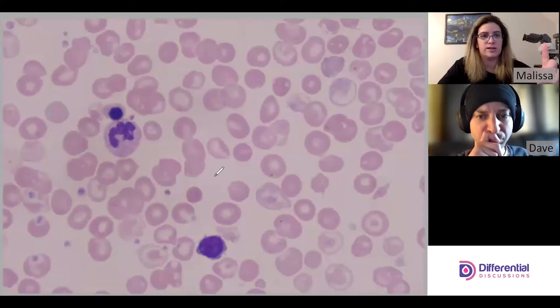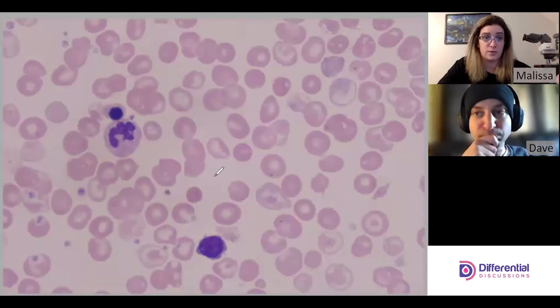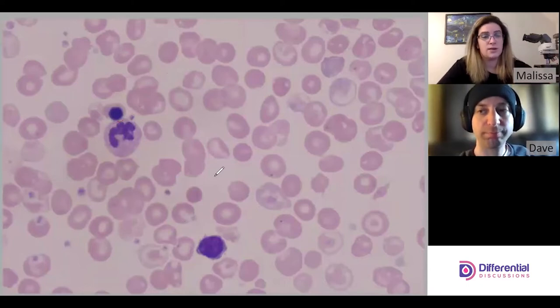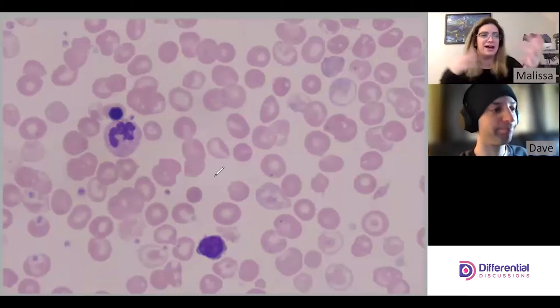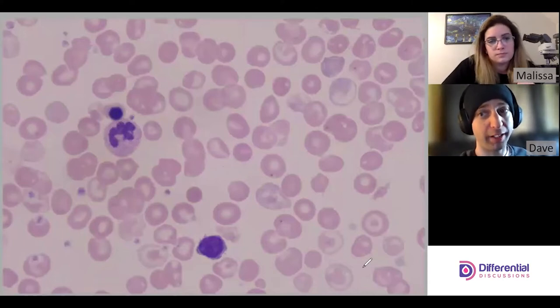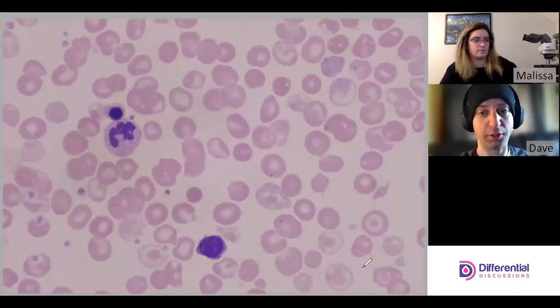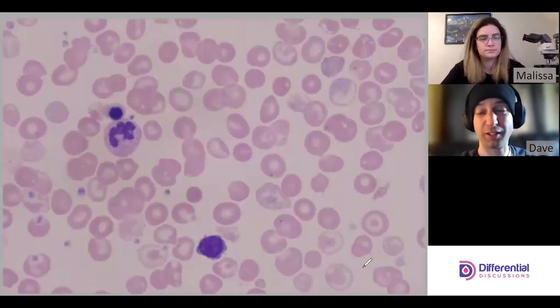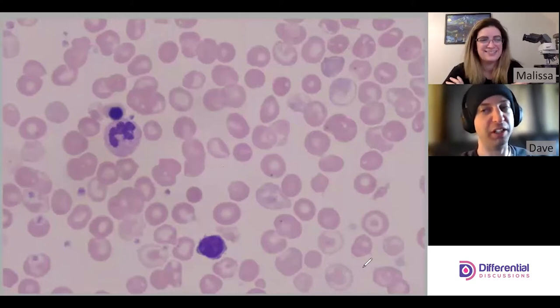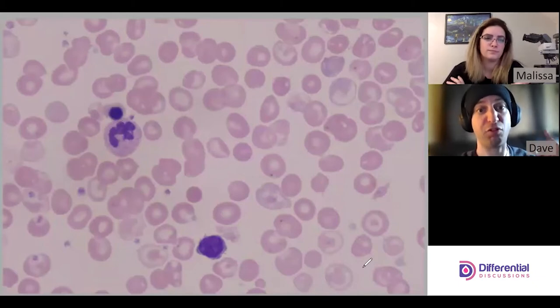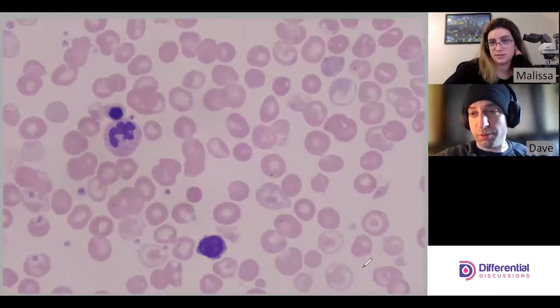Nucleated reds would count as part of your white cell quantitative estimate, but in a differential they're not part of the diff — you count NRBCs per 100 white cells as a separate tally. The reason is that clinicians use the white cell count as an inference of the immune system's capabilities. Nucleated red cells have no immune function, so including them would give a false impression of immune capacity, and we don't want to do that.